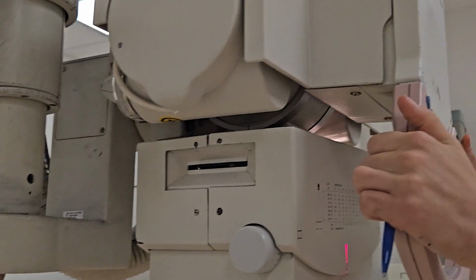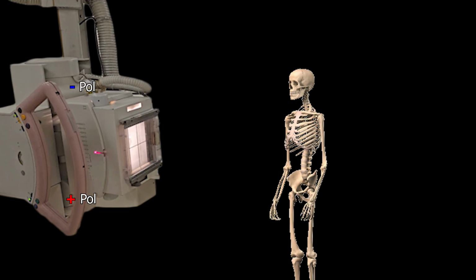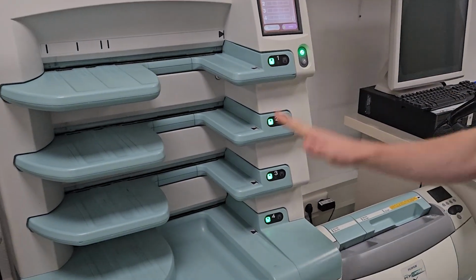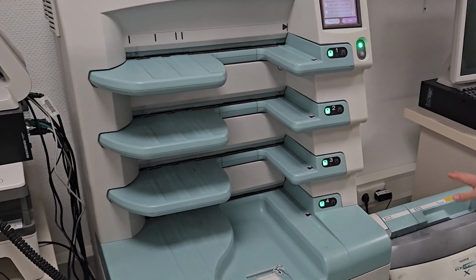So now that we know how the X-ray beam is created, how to set it up, what precautions you should take when exposing, now how is the X-ray image actually created? These are memory foils, which are regularly checked for defects and are reusable. They are read out in a device that looks something like this. Yes, this is a bit outdated here, but at least no X-ray films are used anymore.